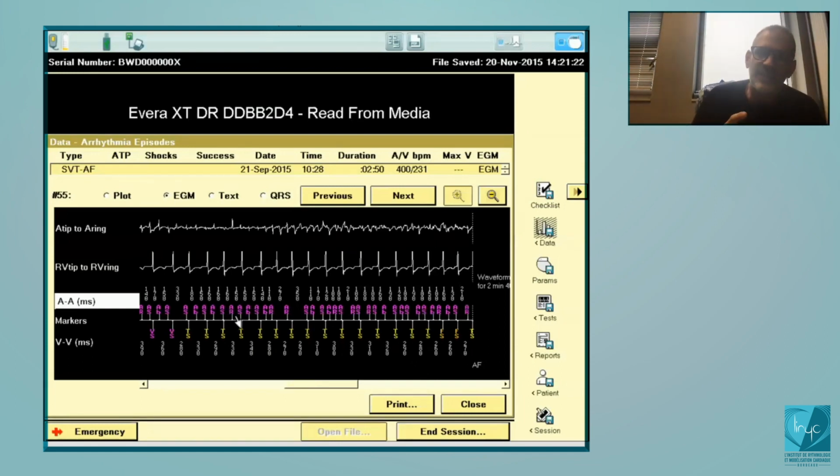First step, is the ventricular rate faster than atrial rate? No. Okay, so are there signs of oversensing, meaning alternance between repetition, long, short? That's not the case here. So you will consider that's a real atrial arrhythmia. Okay, that's compatible. So the 3 options are the same: conducted atrial fibrillation, conducted atrial flutter, and then dual tachycardia.